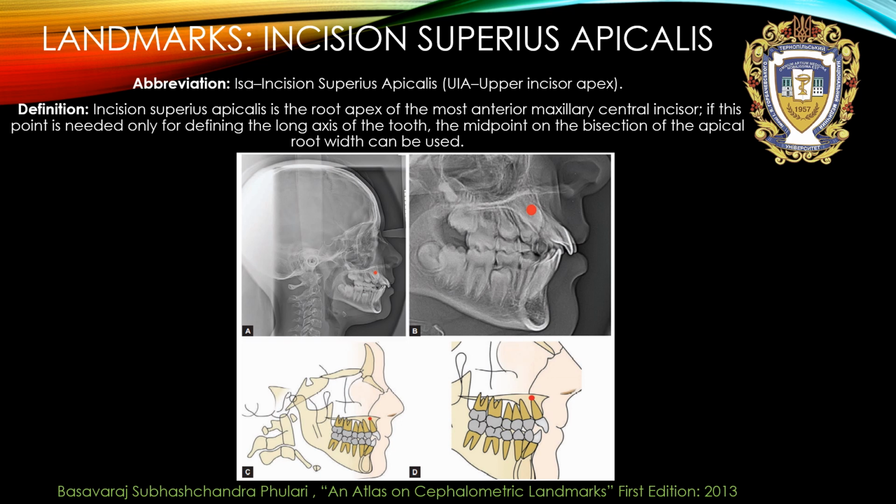Incision superius apicalis, apex of upper central incisor, is the root apex of the most anterior maxillary central incisor. If this point is needed only for defining the long axis of the tooth, the midpoint of the bisection of the apical root width can be used.